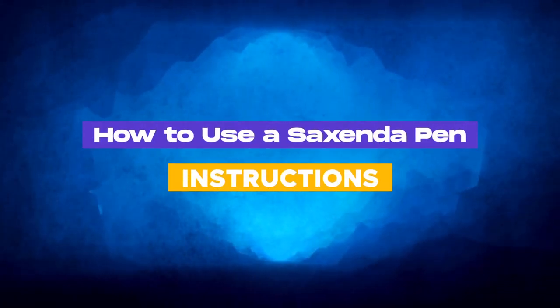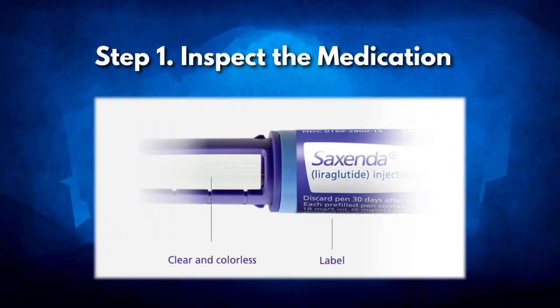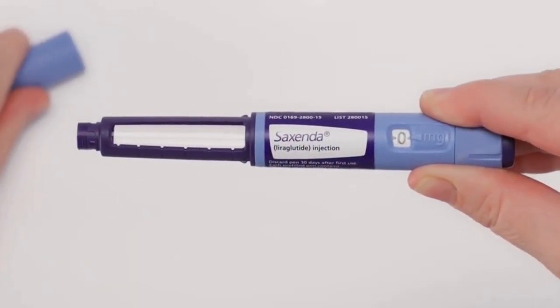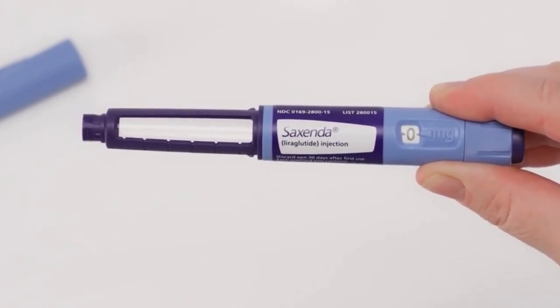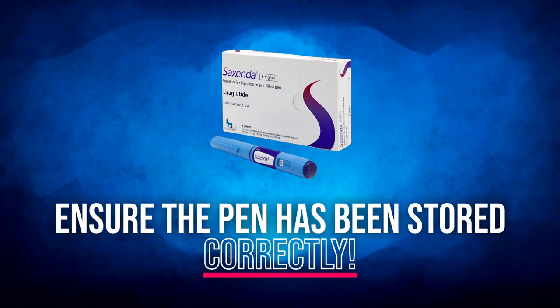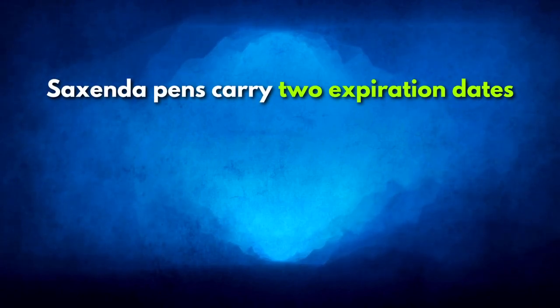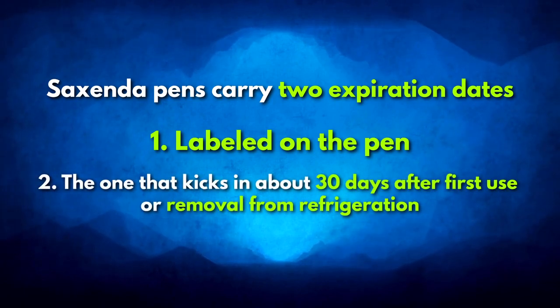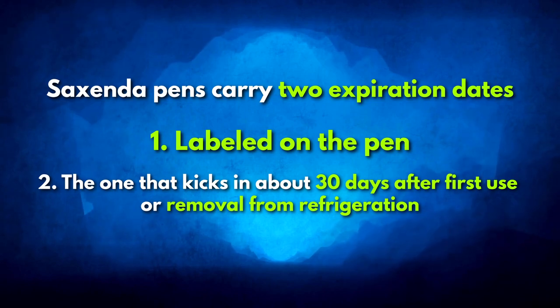Step 1: Inspect the medication. Before anything else, inspect the solution in your Saxenda pen. It should be clear, colourless, and free from particles — signs of a well-maintained medication. Storage conditions are crucial here. Ensure the pen has been stored correctly and hasn't passed its expiration date. Remember, Saxenda pens carry two expiration dates: the one labelled on the pen, and a secondary date that kicks in about 30 days after first use or removal from refrigeration.